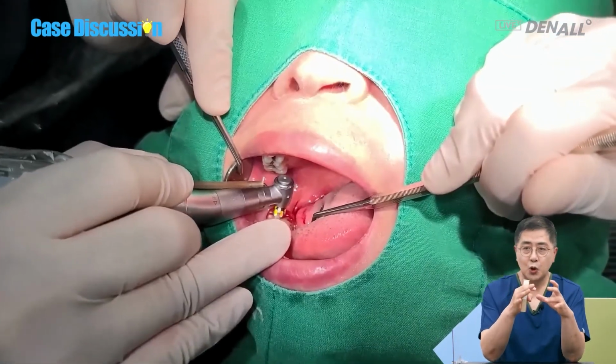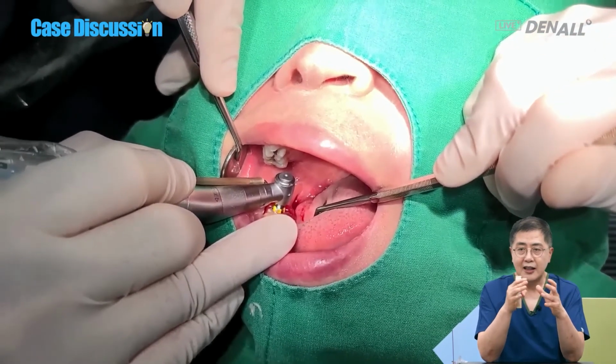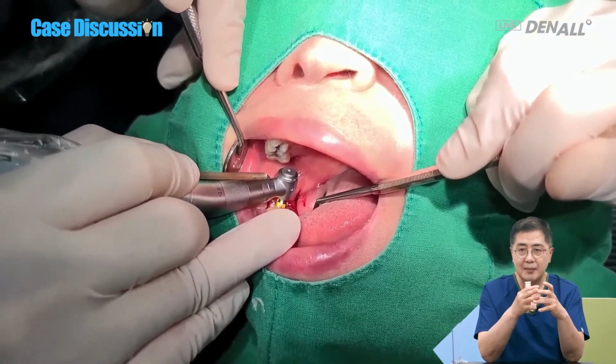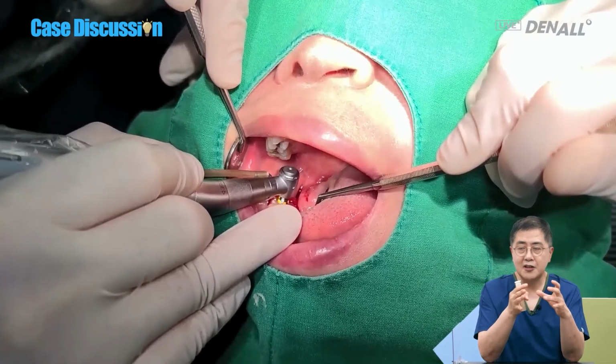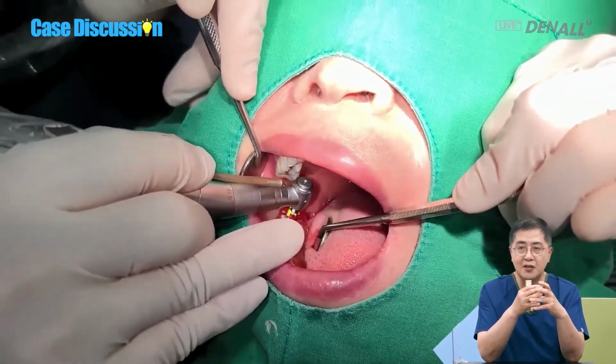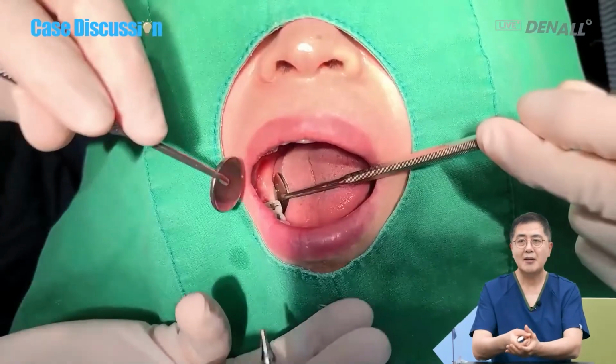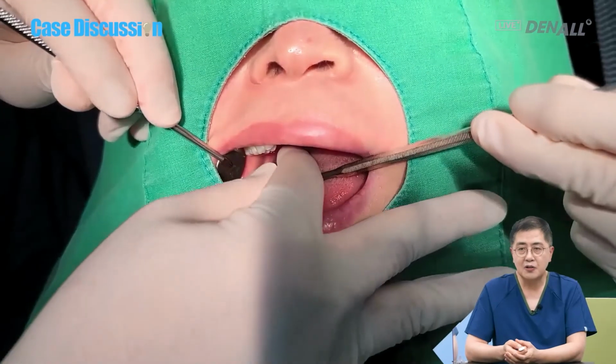Without the guide, we cannot go in there smoothly. The guide enables very stable drilling. Therefore, we can go in there, gaining initial stability at a very slow speed of 15 RPM. Under drilling and using the guide is a very good idea for gaining the initial stability.